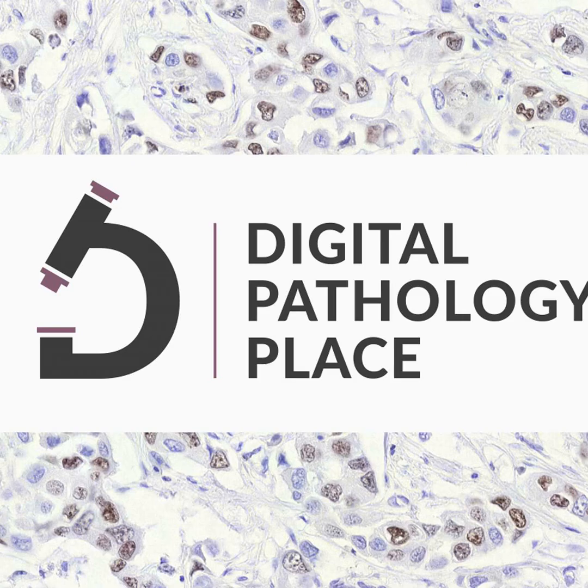A digital pathology scientist or a pathologist performs a wide range of duties, a spectrum of tasks far beyond the scope of current image analysis capabilities. As such, it is unrealistic to expect AI-powered image analysis to replace these professionals. However, AI can undoubtedly assist in performing well-defined routine tasks like detection, classification, counting, and measurement of structures and areas within the tissue. For instance, tissue image analysis can aid in quantifying positive IHC-stained cells or detecting different types of special stains.